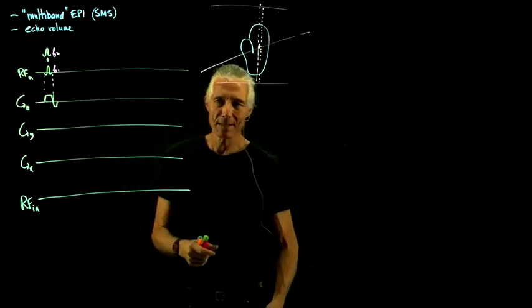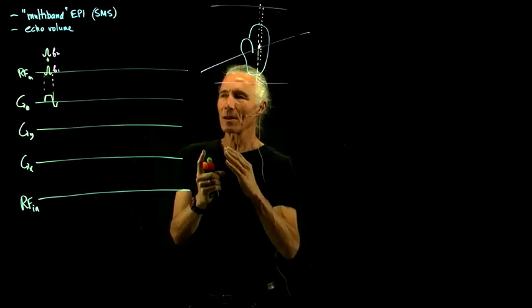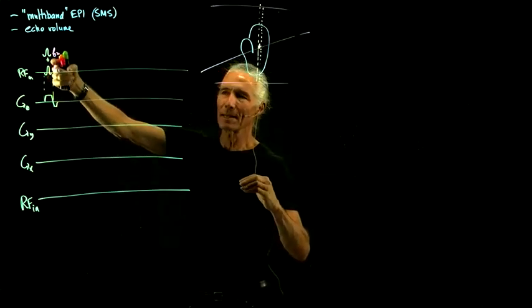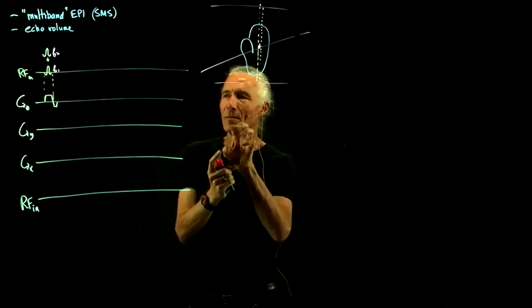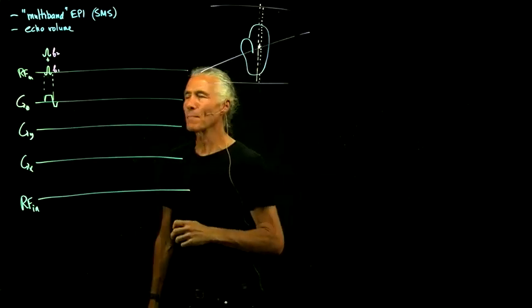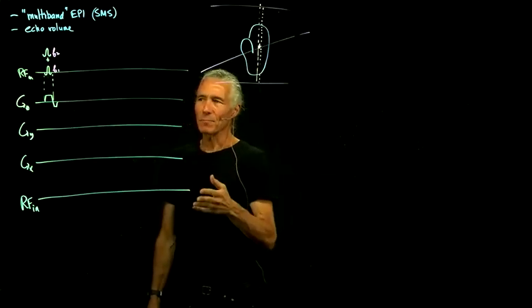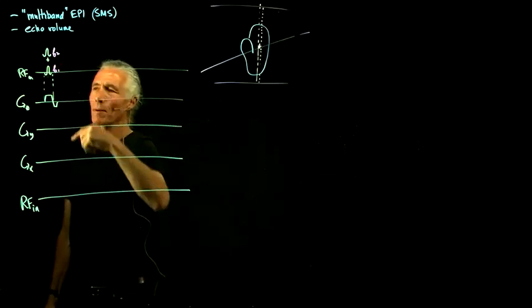One problem that comes up is that you could have too much RF power, because the very center of the sinc is a high peak in RF power. So there are various tricky ways of offsetting them a little bit so that all the peaks don't come at exactly the same time, and then fixing up the phase problems you get from that. But in any case, you can basically just add two sinc pulses to each other.